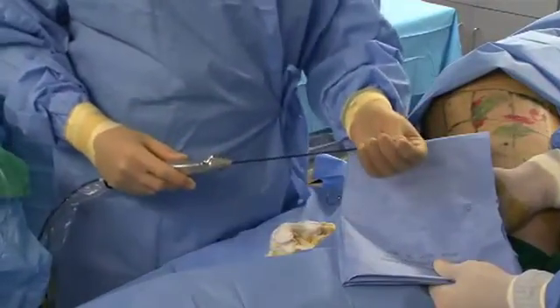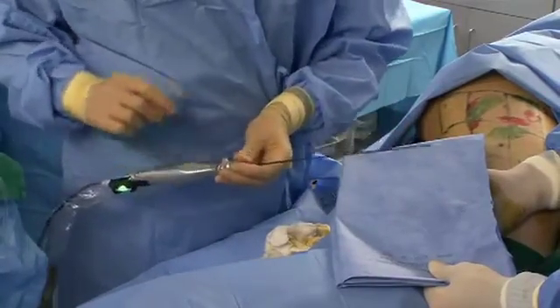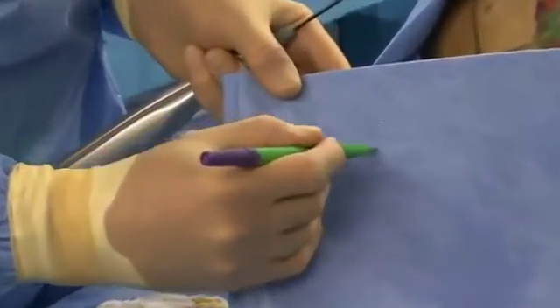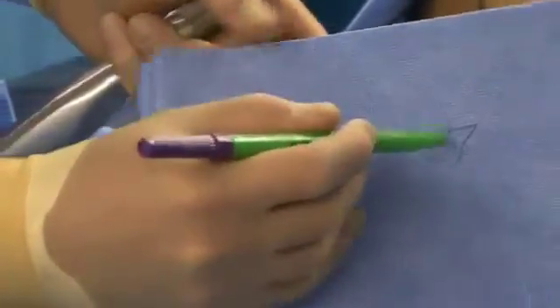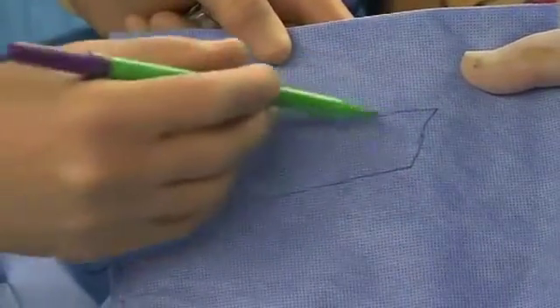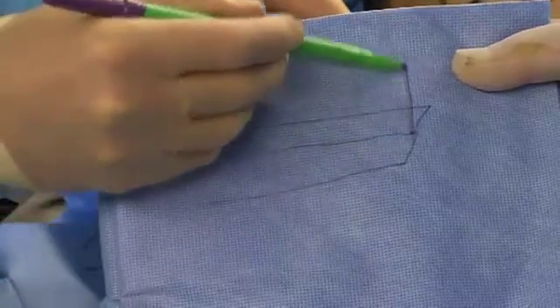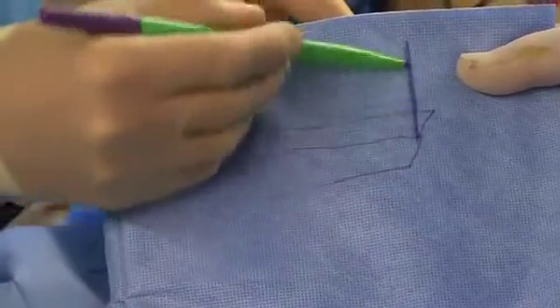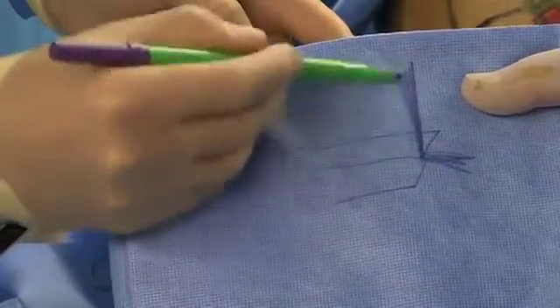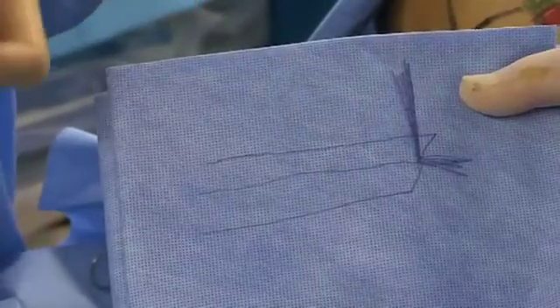The fiber itself is called a side light, and it's very tiny, it's very hard to see, but what's going on here is we have a bevel in the laser, like this, and that's like a mirror, and the light is traveling, hitting that, and then coming out to the side. There's a little bit going forward as well, but most is going out to the side, and this is how we're going to be treating the components of the cellulite.